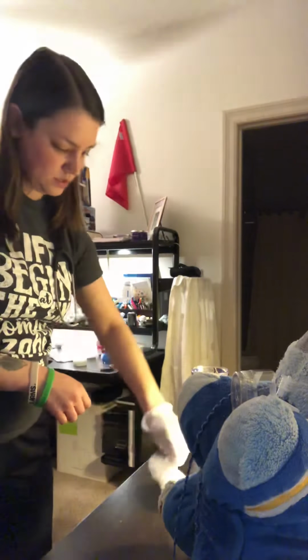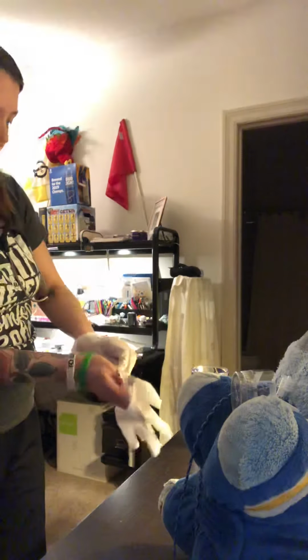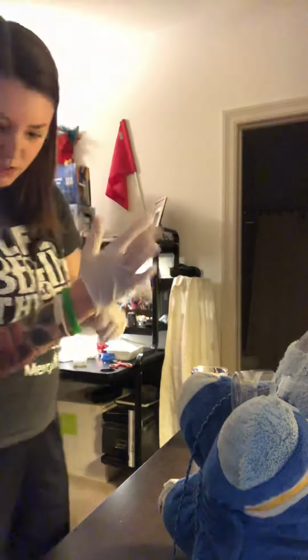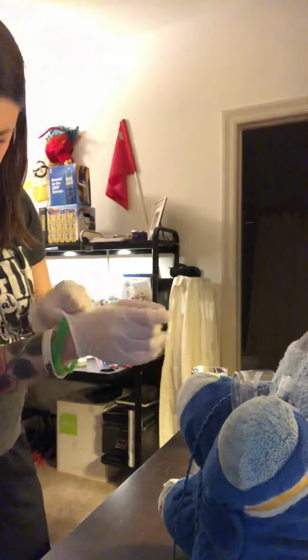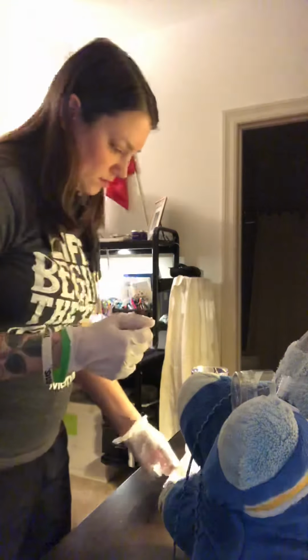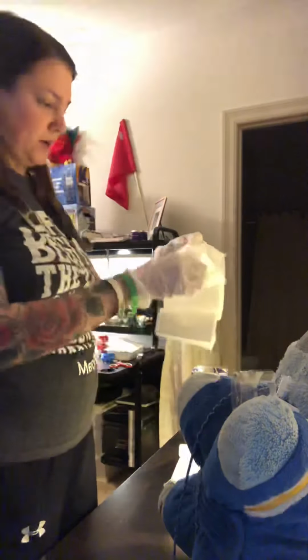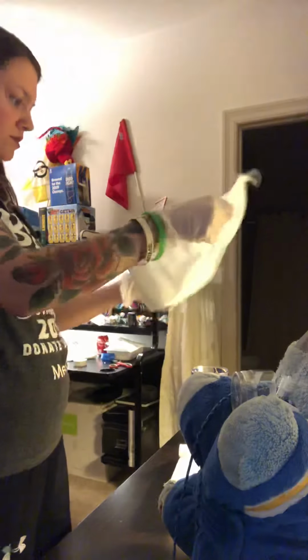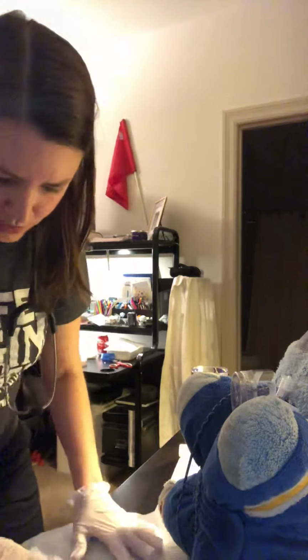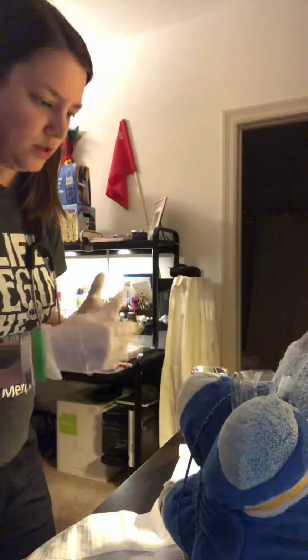And then same with my dominant. Okay. So then now I will drape the patient. This won't stay very well with my little guy here, so I'm just going to act like it's on him. Sorry, it's not going to stay very well, but it would be draped over the patient.